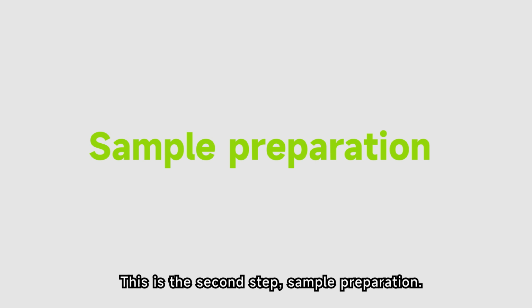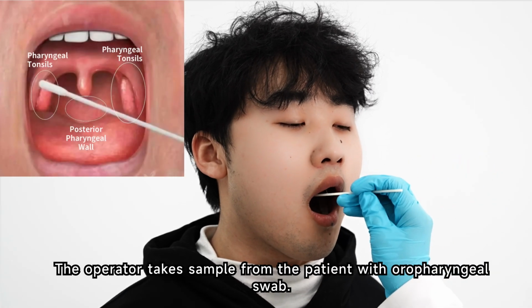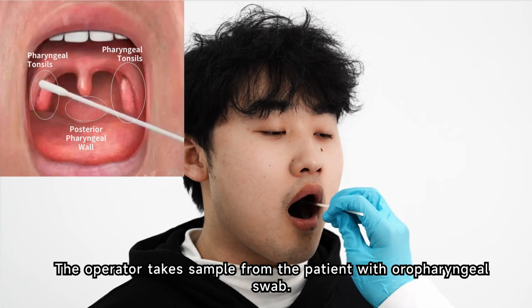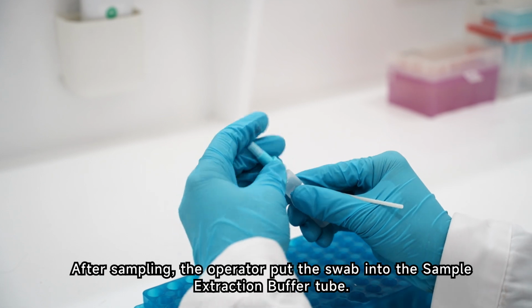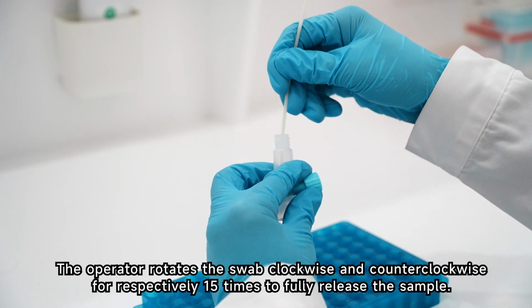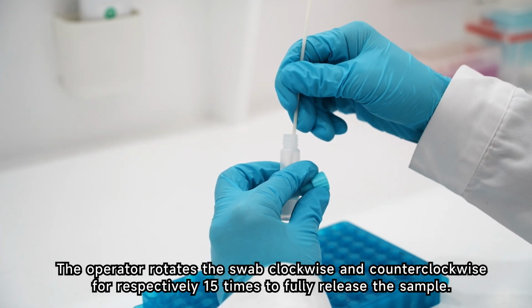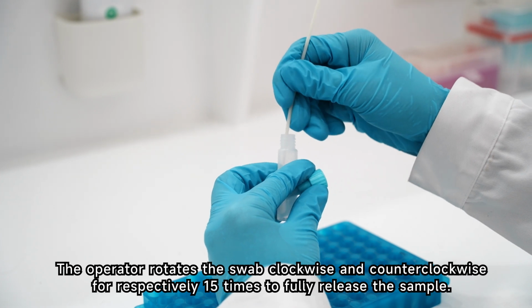This is the second step, sample preparation. The operator takes a sample from the patient with an oropharyngeal swab. After sampling, the operator puts the swab into the sample extraction buffer tube. The operator rotates the swab clockwise and counterclockwise, respectively 15 times, to fully release the sample.